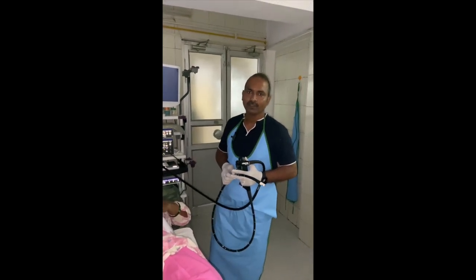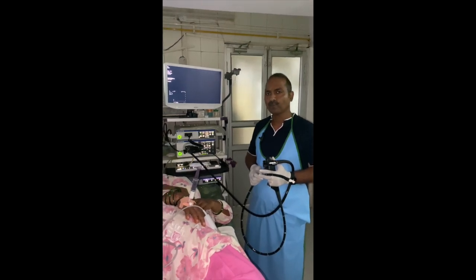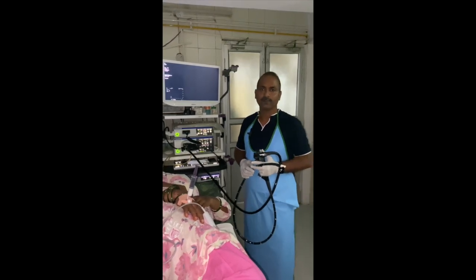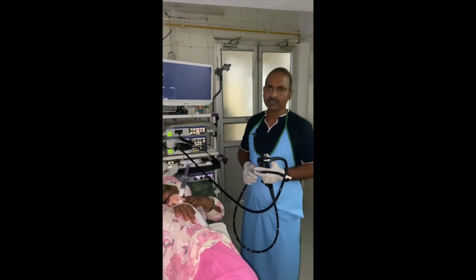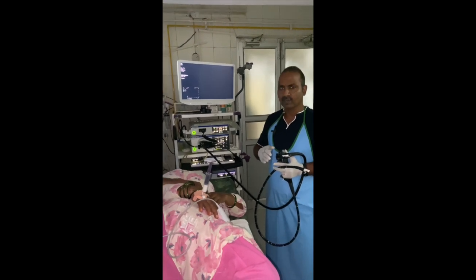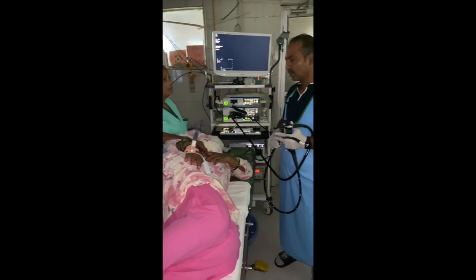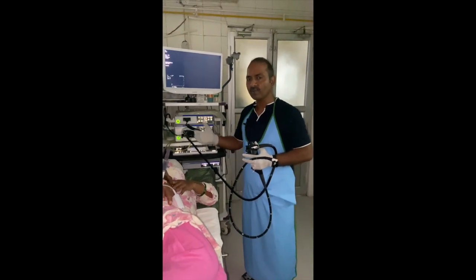Ajit Kumar Rawat. Today we are going to demonstrate how to identify the different liver segments with the help of endoscopic ultrasound. So we are going to use the EUS ME3 scope from Olympus. The patient's position is in the left lateral position, and it is same as we do in the routine endoscopy. And the scope insertion procedure is same as we do for the duodenoscopy.